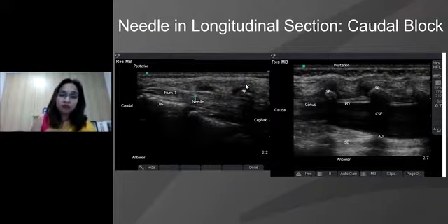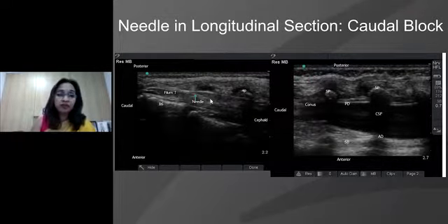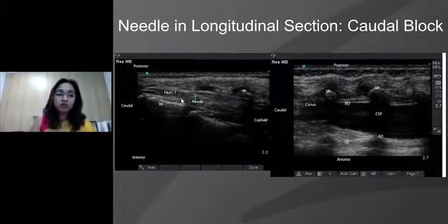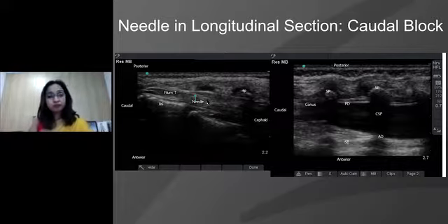This will be the skin and subcutaneous tissue. These are bones. These are sacral spines, and hence you can see that there are shadows here, and you can see the entire filum terminale, and this is the base of the sacrum. So this actually is the caudal epidural space, which is filled with the filum terminale. The needle has already walked amidst it, and we are yet ready to inject the drug.